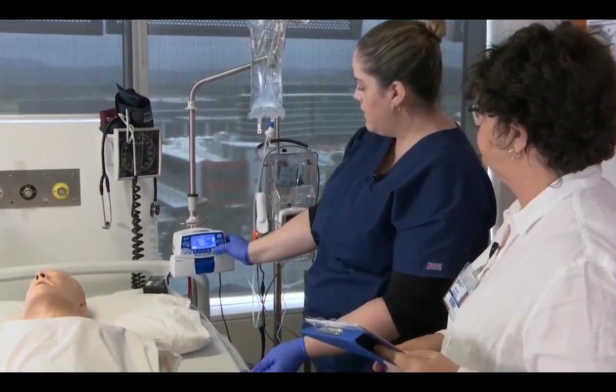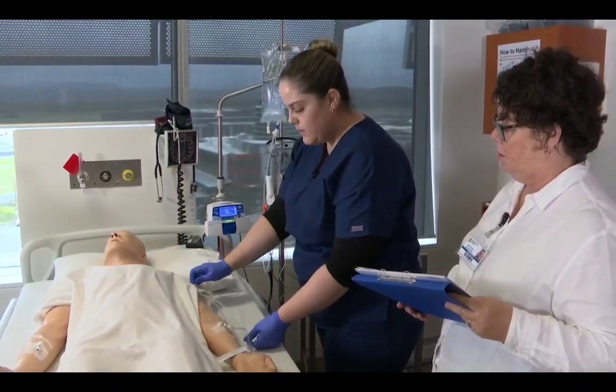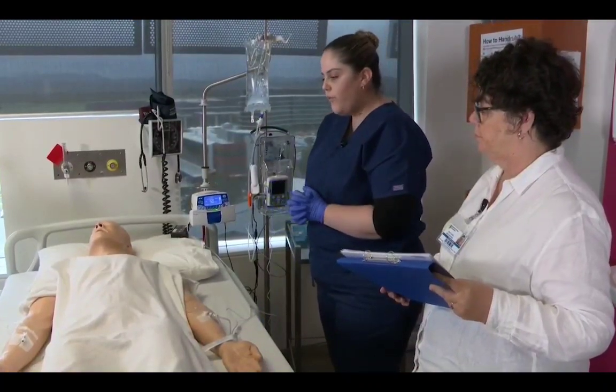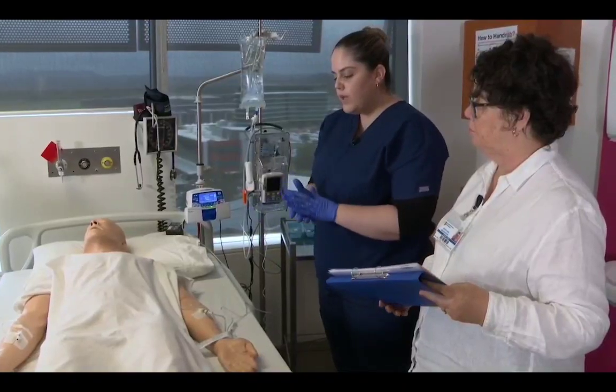Perfect. Correct. And then start. Okay, so they're both started now. I'm just going to get a bit of tape in a second when I come back and tape that in. John, does that all feel okay for the moment? It does? Okay. So we're going to leave that run just for a second.